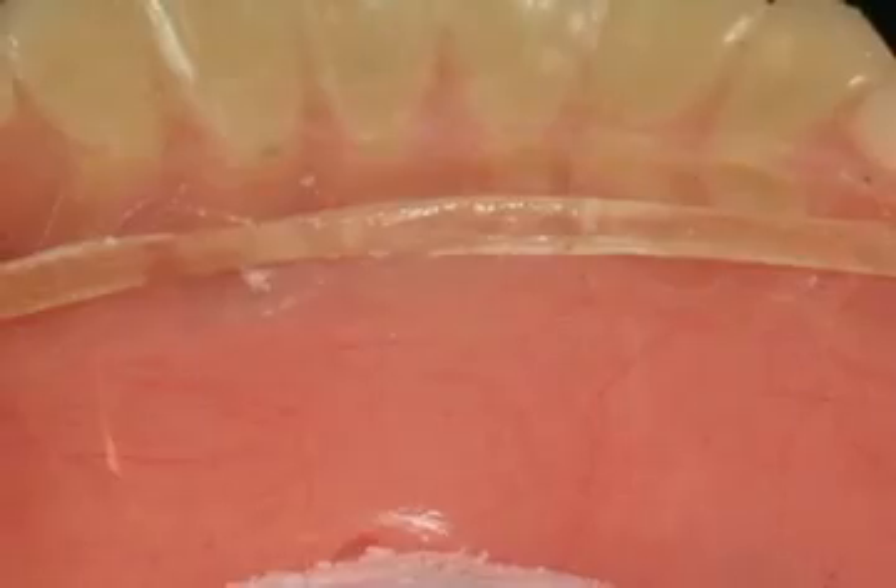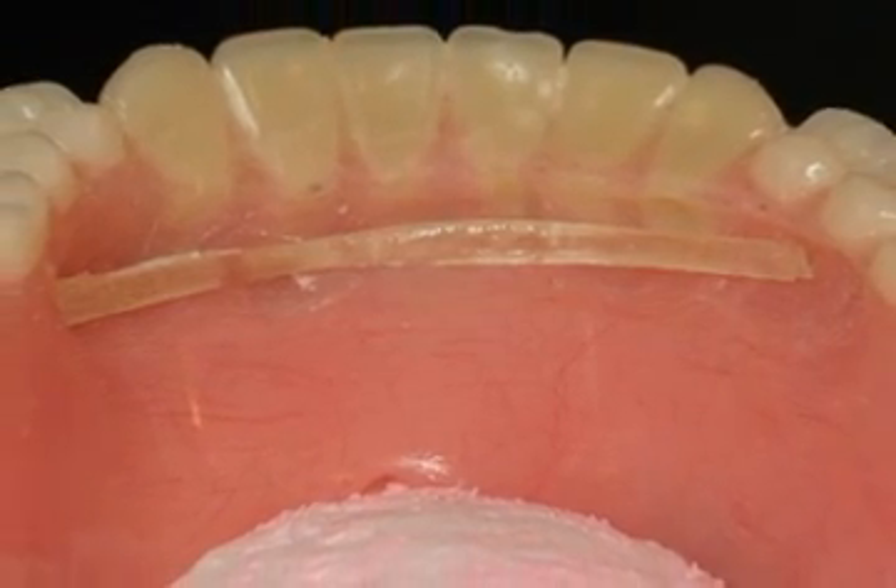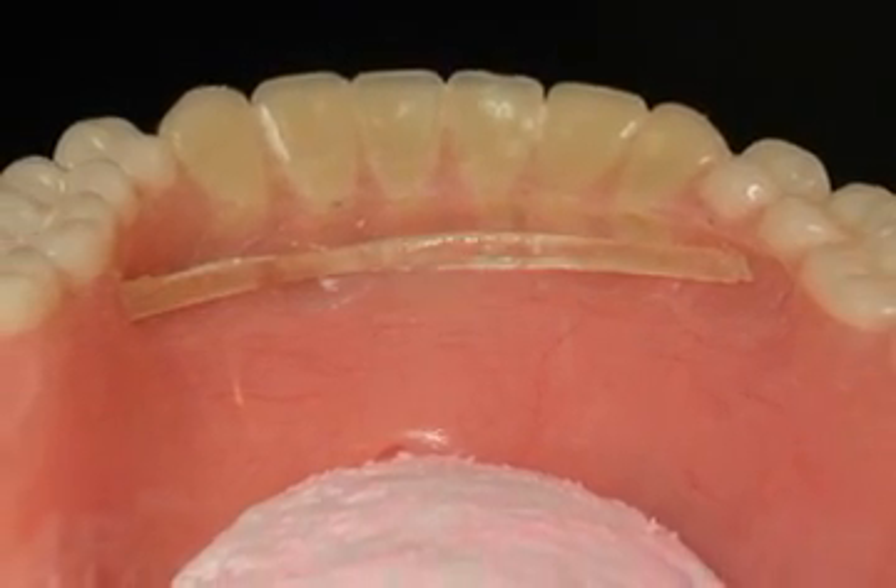The reinforcement fiber should be positioned in the weakest area, such as the junction of the teeth and acrylic. The reinforcement should be placed perpendicular to the crack.